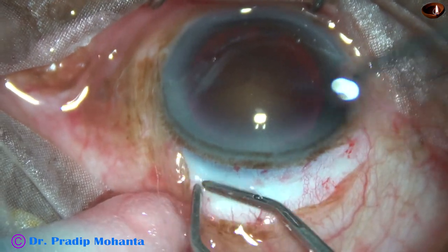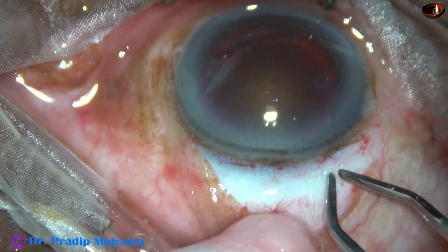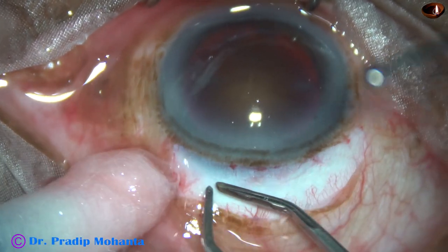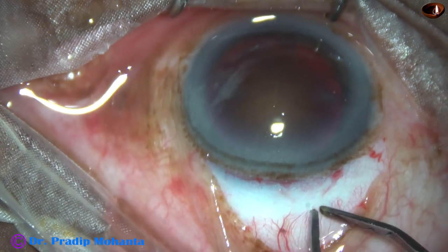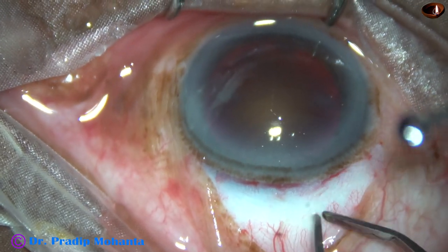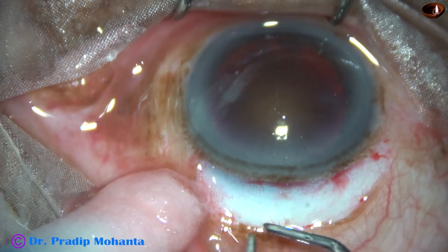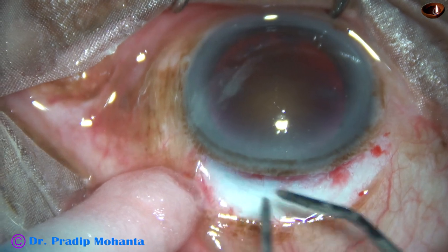Very rapidly new blood vessels will grow and this area will be nicely vascularized in few days. But the anterior ciliary arteries that are piercing the sclera are protected.